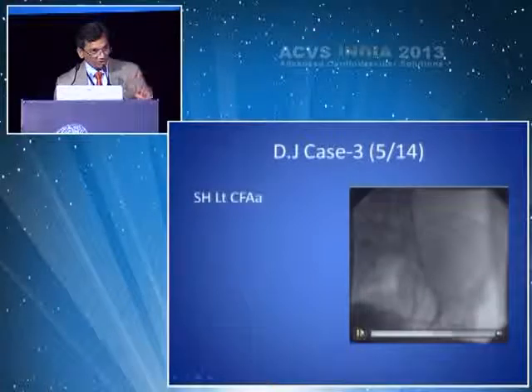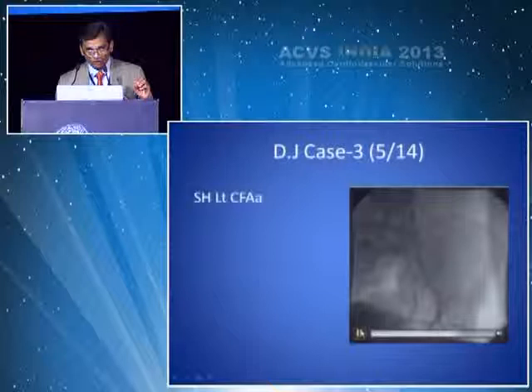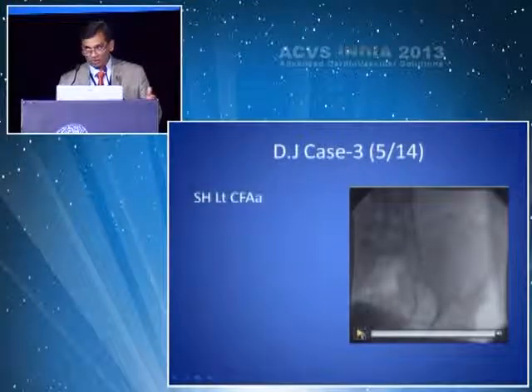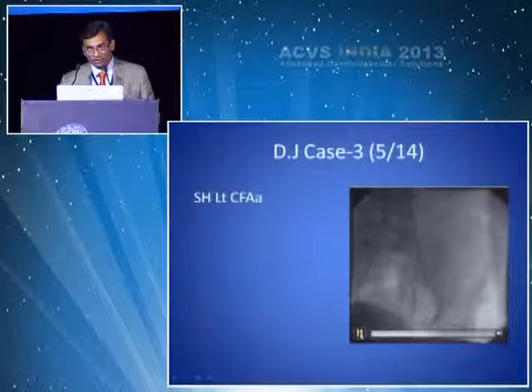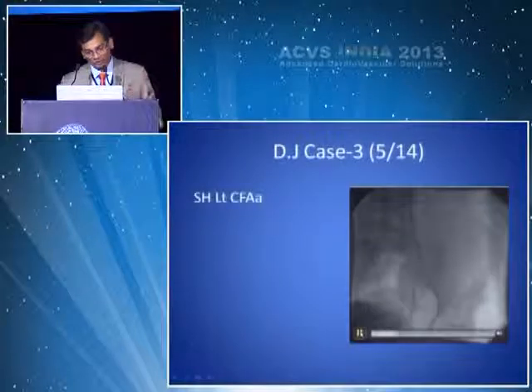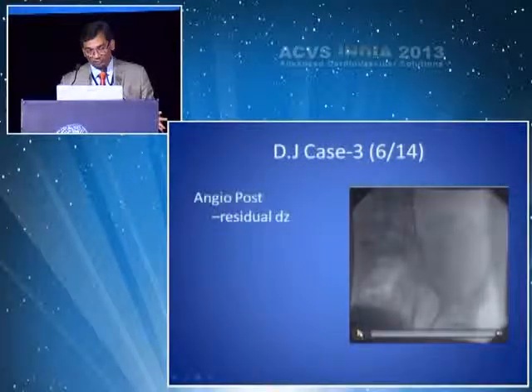Again, you should resist the temptation, after you've done the first two or three passes, to just balloon or stent it at this point. That's the wrong thing to do for peripheral vascular disease, because you create dissections, you create distal embolization, and you create a restenotic milieu for the future. So I strongly suggest, and I say this passionately, go for optimal atherectomy. This is a case to demonstrate that.